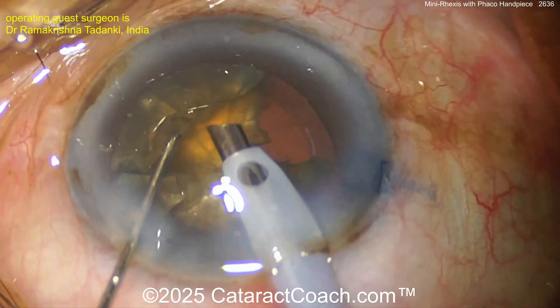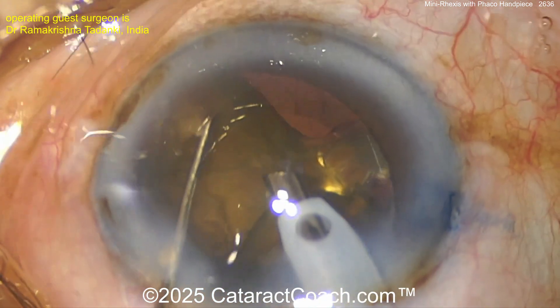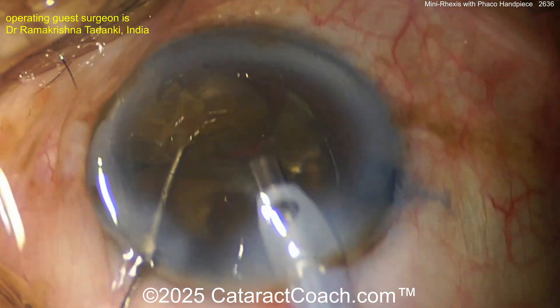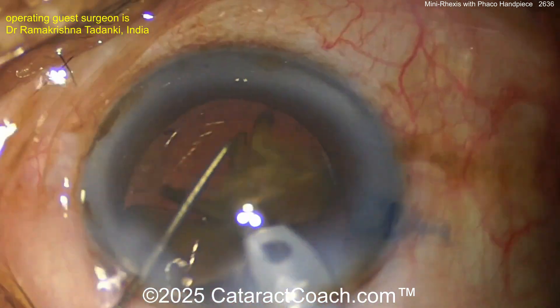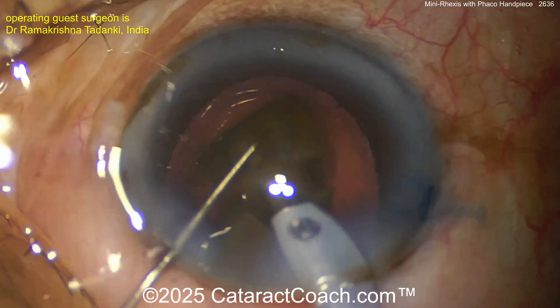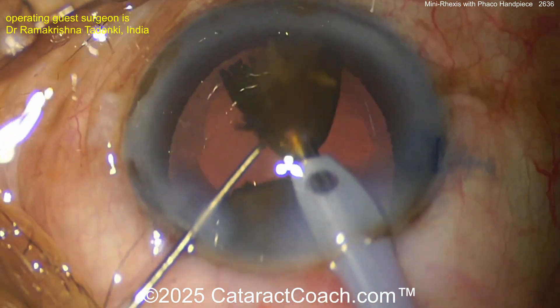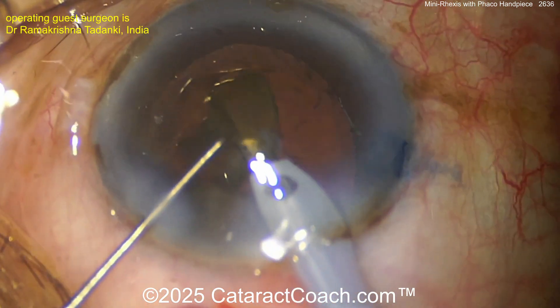The pieces come up very nicely — neat technique. There are so many different methods of addressing an intumescent white cataract; it's always impressive to see the ingenuity of ophthalmologists around the world. The mini-rexus was done with suction from the phaco probe, which was used in cortex removal or IA mode — so no matter how much you push the pedal, you won't get position three and accidentally deliver ultrasound energy to the capsule.